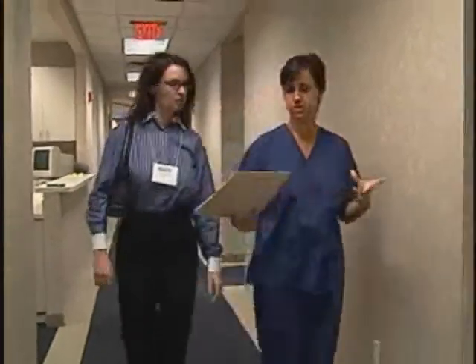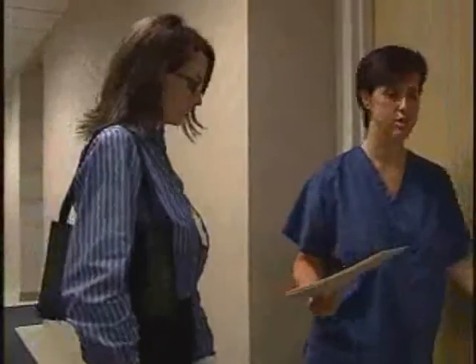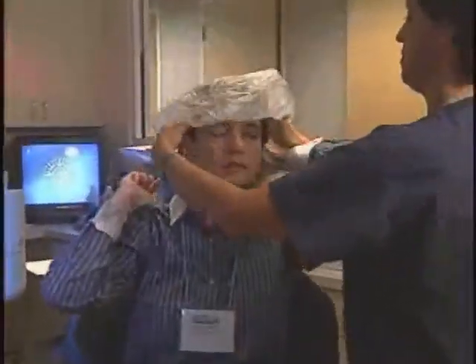It is also important to think of laser vision correction as a process rather than as an event. Everyone responds slightly differently to the laser energy, and although most patients are able to drive the very next day, vision may not seem optimal, may fluctuate, and about 5 to 10% may require fine-tuning of their vision several months later. Most patients, however, whose vision is somewhat blurry in the days following their procedure go on to have excellent results days to weeks later.